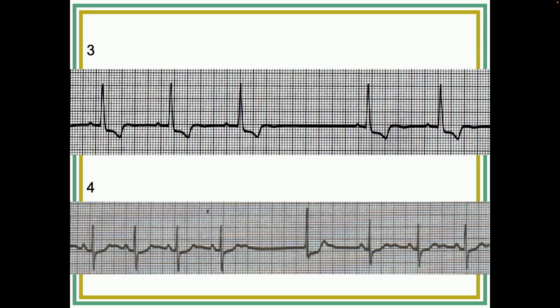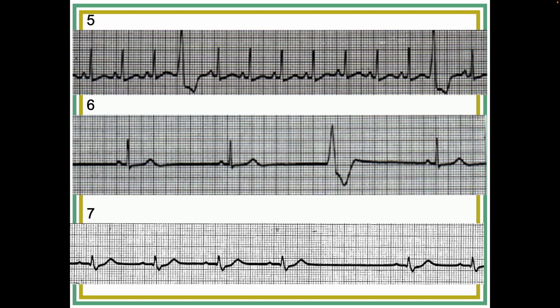So let's go back. I think, Kyle, you were supposed to be next, and I gave yours to Spencer, but here you go, number 5. Number 5, I had this written down as sinus tach at give or take 120 beats a minute, with a premature beat right there. And where's the other one? Oh, the other one right there. Okay. So, sinus tachycardia with 2 premature beats, yeah.